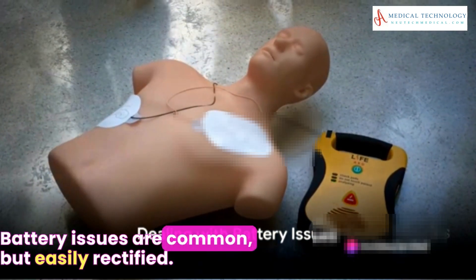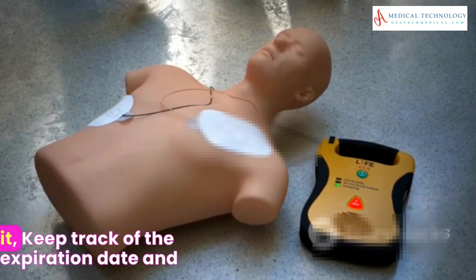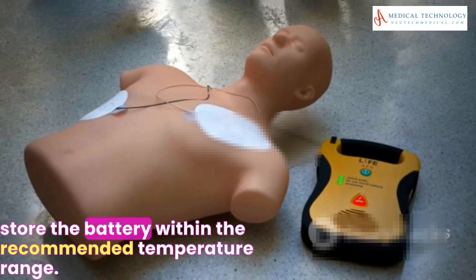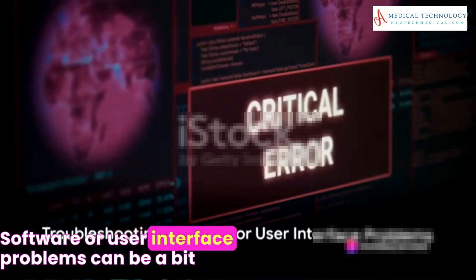Battery issues are common but easily rectified. If the battery isn't holding a charge, replace it. Keep track of the expiration date and store the battery within the recommended temperature range.